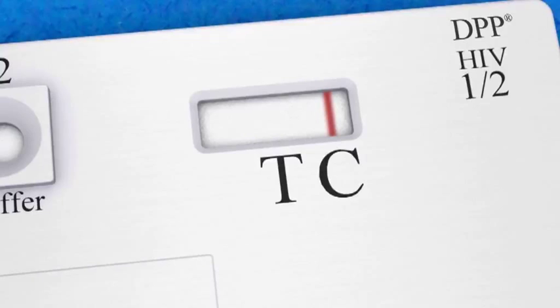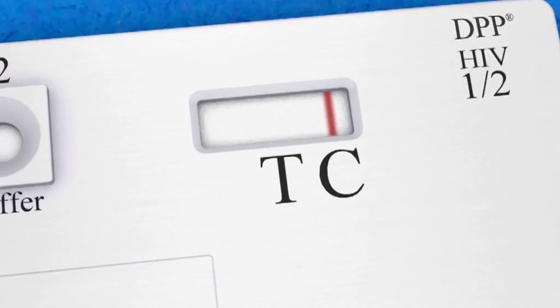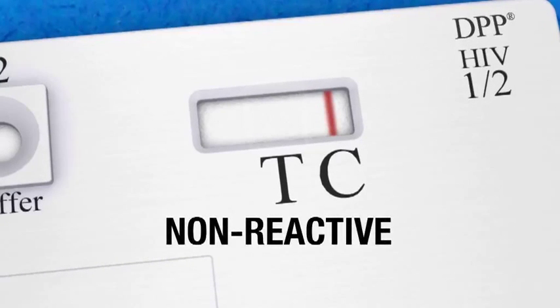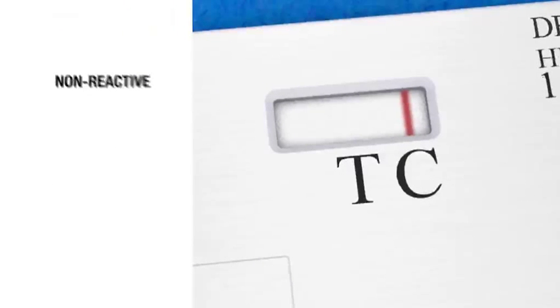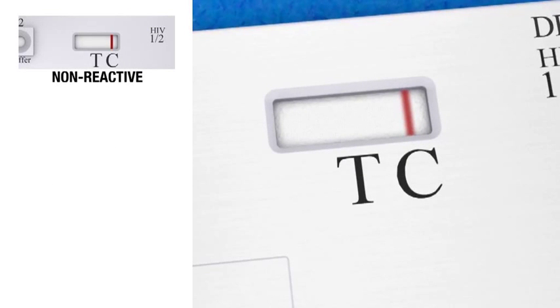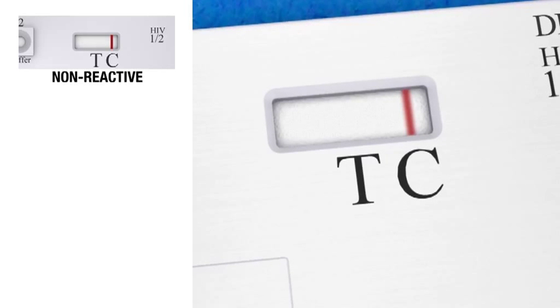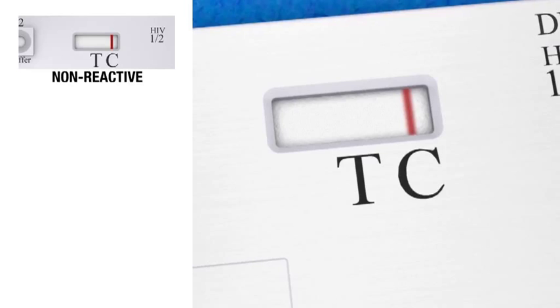If no line has formed above the T marking in the test window, the result is non-reactive, meaning that the patient is preliminarily negative for HIV-1 and or HIV-2 antibodies. Be aware that this does not necessarily exclude HIV infection.